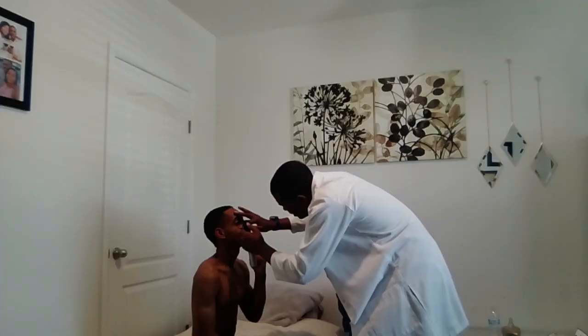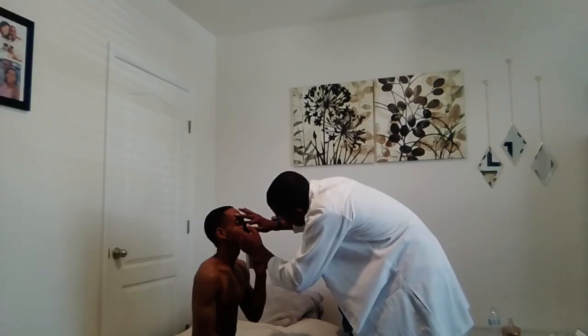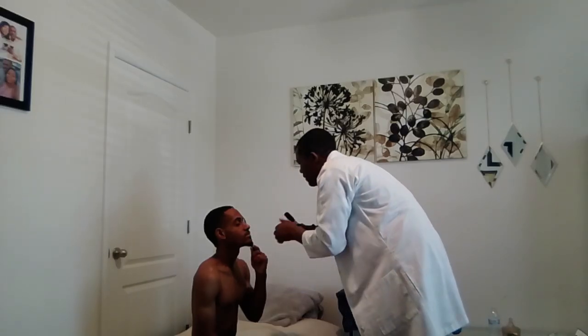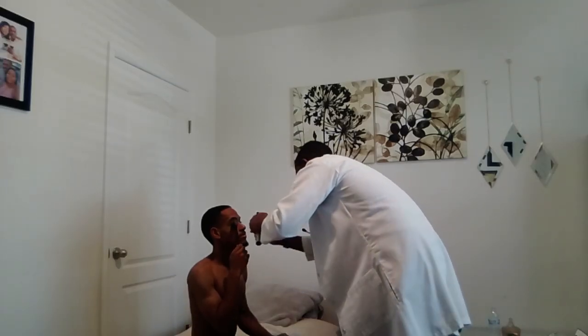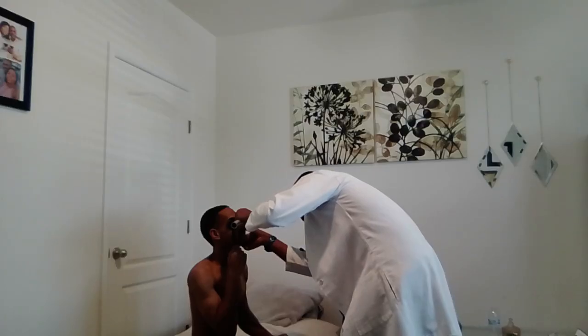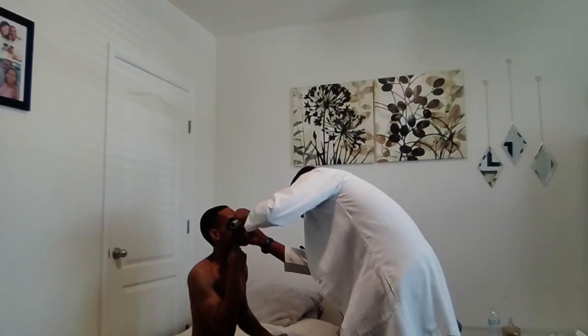Open your eyes, Frank. There is no hemorrhage, normal blood vessels. I can see the macula and landmarks normal. Okay, do the other side for me, Frank. Okay, I can see the optic disc is intact. No hemorrhage, normal blood vessels. Can see the macula.